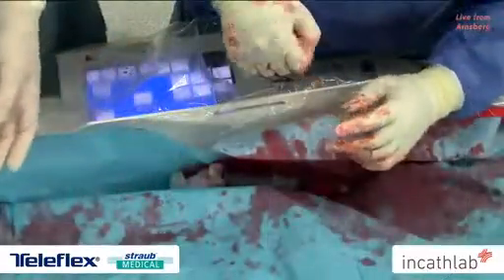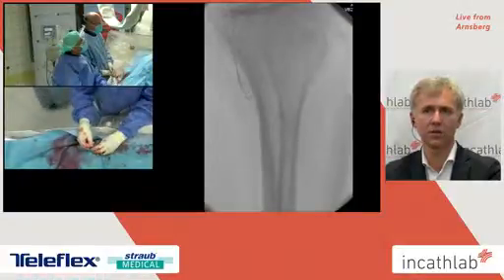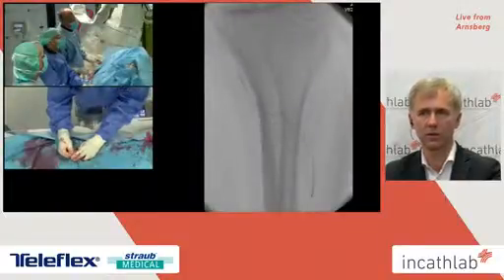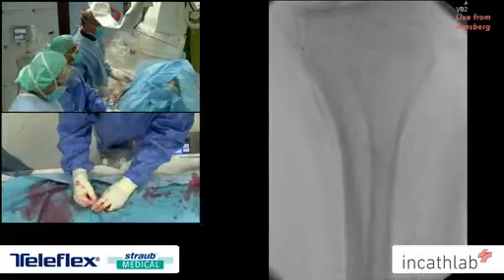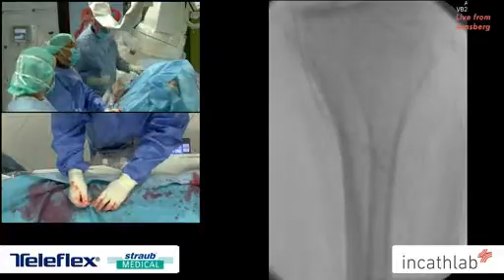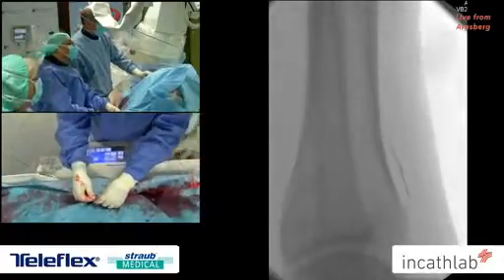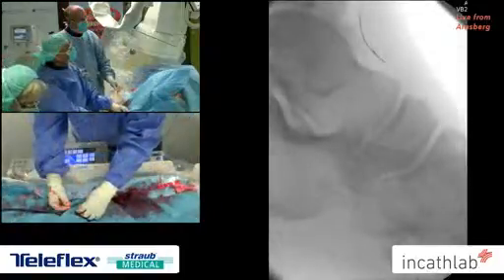But in this case, you already opened the P3 segment and went into the anterior? Yes. Okay, and now you try to get to the trifurcation. No, we already have a wire in the peroneal and the second wire in the anterior. And then, after the angioplasty in the ostium of the anterior, that was particularly difficult to engage because of a calcified plaque involving the ostium and the first tract.